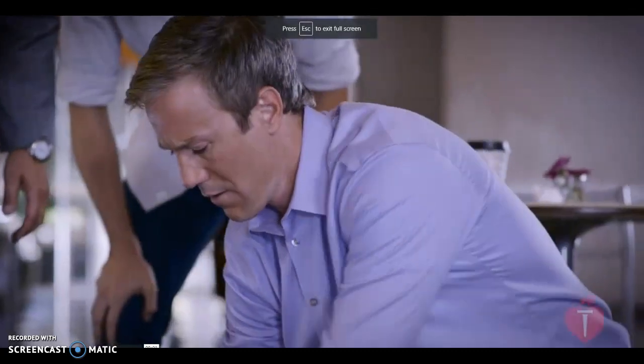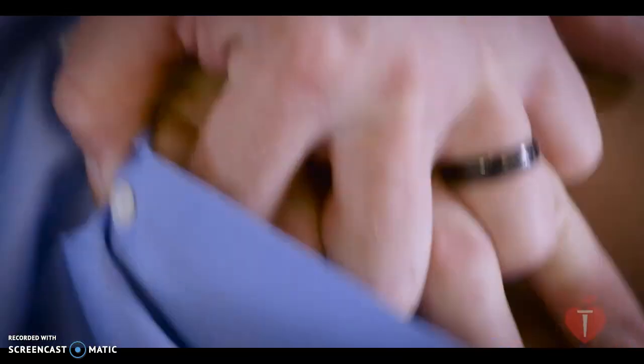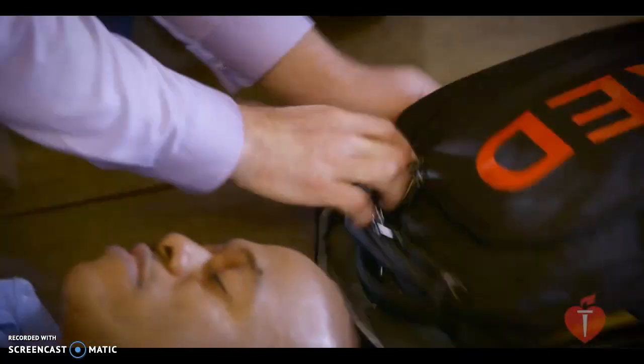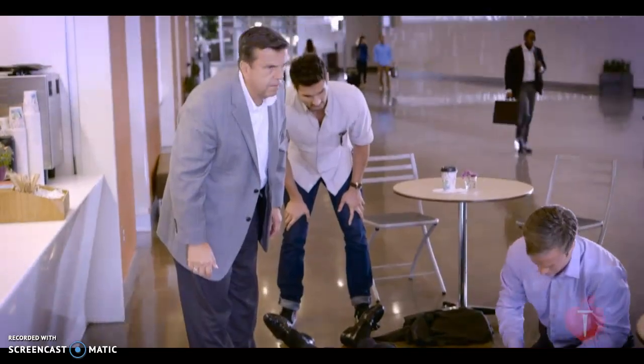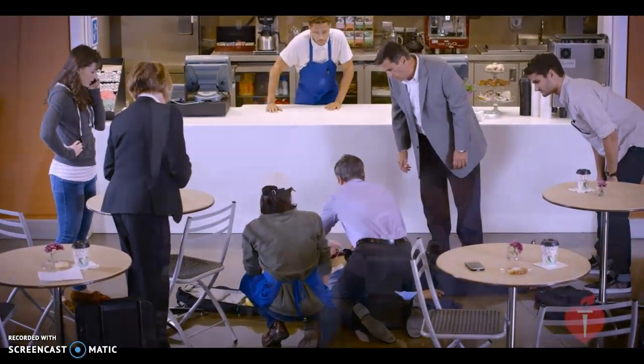By now, you've learned how to provide compressions and give breaths with and without a mask. Let's look more closely at using an AED. Even though you may be in the midst of providing CPR, once the AED arrives, use it immediately. Let's go back to our scene with Gene and Anthony. We'll pick up just before the AED arrives.